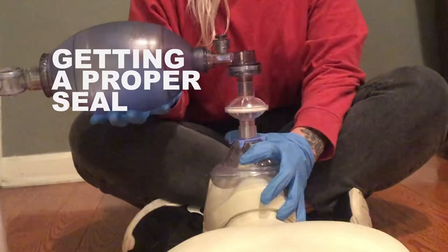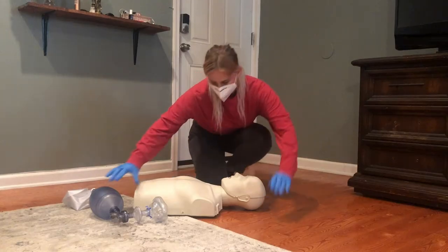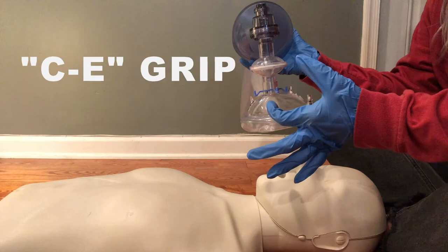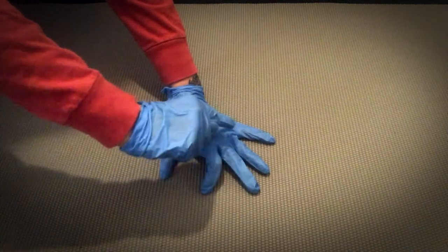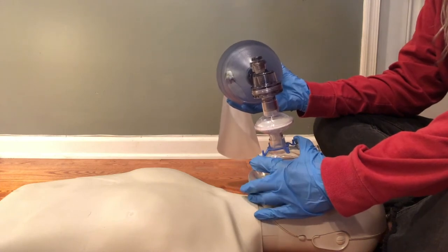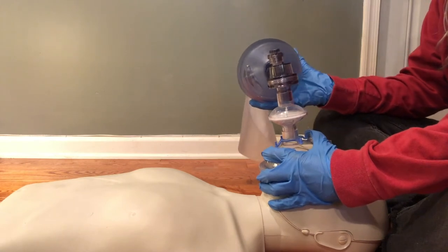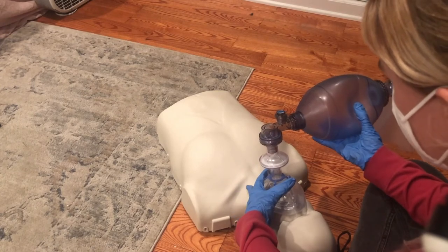Getting a proper seal is an important part of bag valve mask ventilation to ensure that no air is escaping through the sides of the mask and to ensure that oxygen is going into the lungs and not the stomach. It's best to position yourself behind the person's head. We want to use the CE grip. It's called CE grip because your thumb and index finger make the shape of a C, and the other three make the shape of an E. You place the E fingers under the mandible, or chin, and pull the mandible upward, while the thumb and index fingers create a C around the mask and press down against it. Hold the mask between your thumb and index finger around the stem.